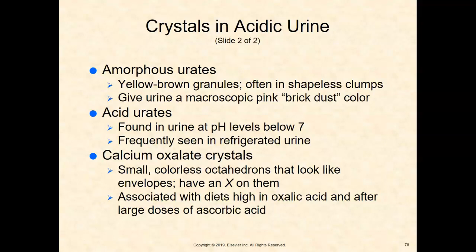If we let it sit in the refrigerator, these crystals can start to form and it makes our job a little bit more difficult under the microscope. Okay? You can try to warm it up underneath a warm sink by putting the cup under some warm water. That doesn't always work the best. It's always best to get a fresh urine if you can.